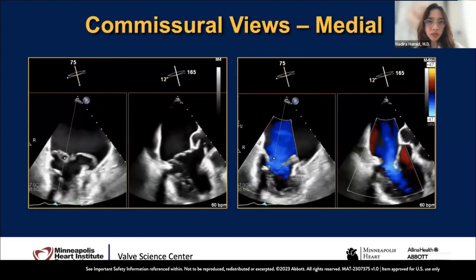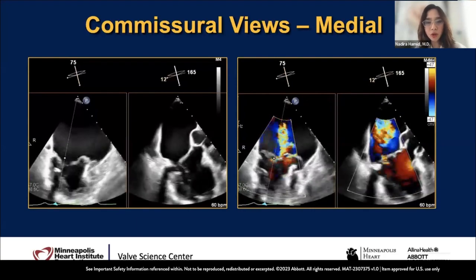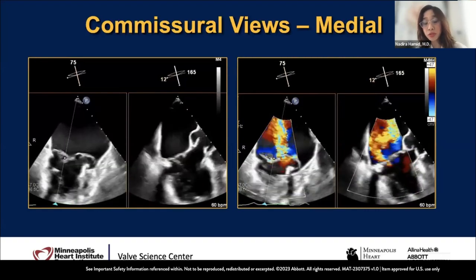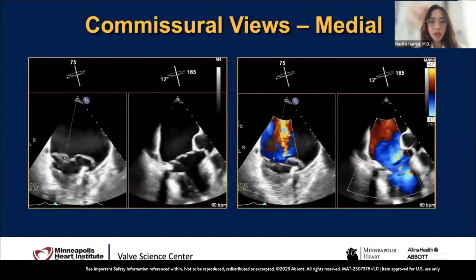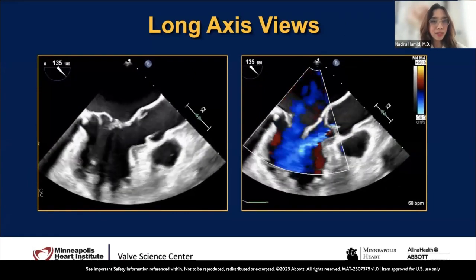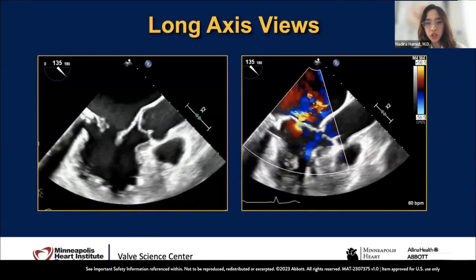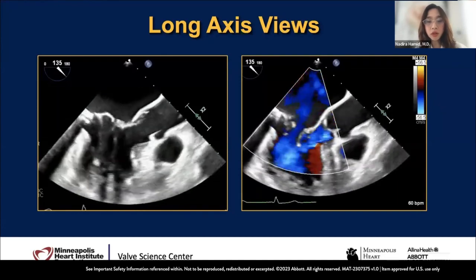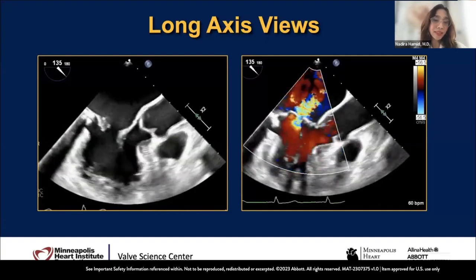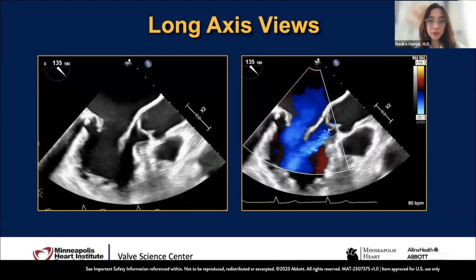If it's pre-screening or even on the table, don't rush, take your time with adequate sedation, calm the patient down. I know moderate sedation can be quite challenging, depending on the blood pressure, but take your time to get the views because these are key views in terms of the decision making. And so moving from the commissural view, then obviously as you move forward from 75 to 90, and then of course the long axis view. So this is the view where you see the length of the posterior leaflet, where the jet is, and certainly in terms of the grasping view, I think we use a lot of this long axis view to determine the length of the leaflet into the clip, which you'll see in a couple of cases that we will be showing in the next couple of minutes.